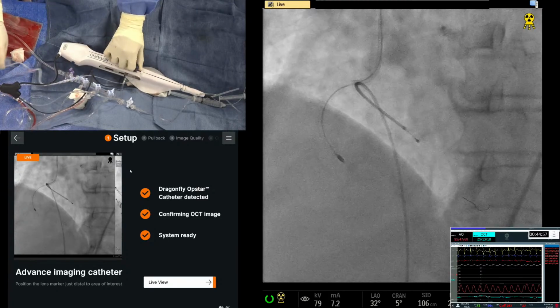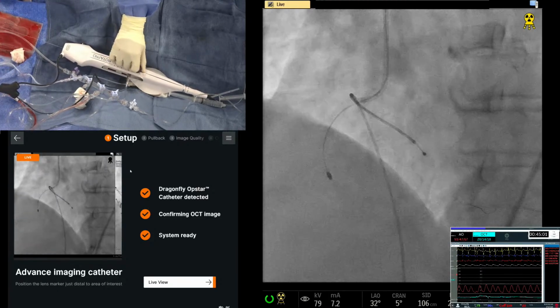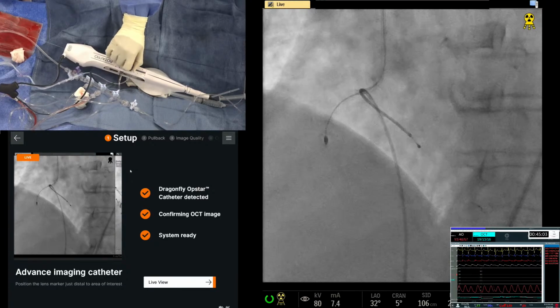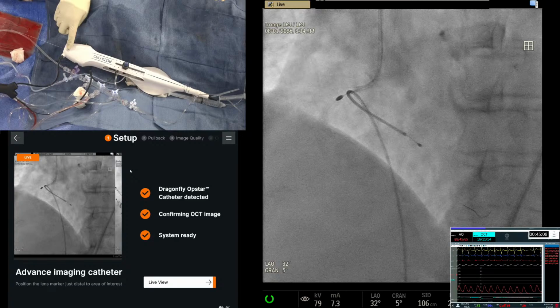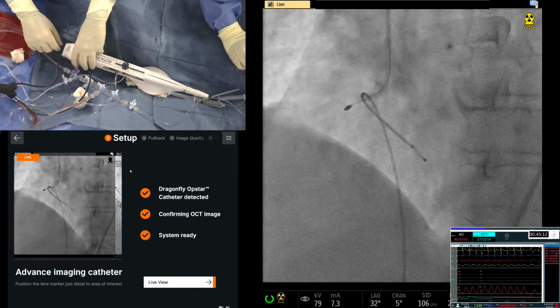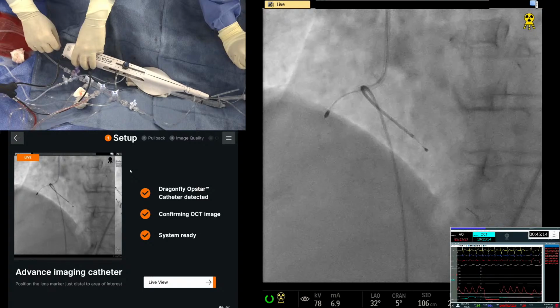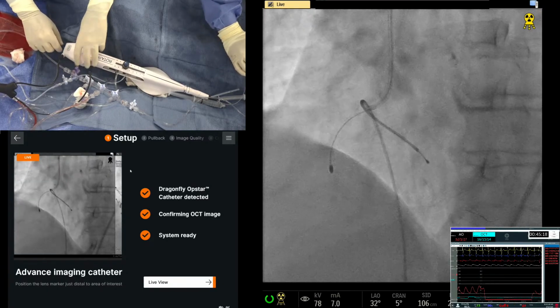Second lesion was okay. Now we are going to the third. Do we need to move again? Okay, let's do a little movement. Okay, this is the third time we are trying to get more purchase of the burr. So if anybody has questions how to do this, okay, good, stop.